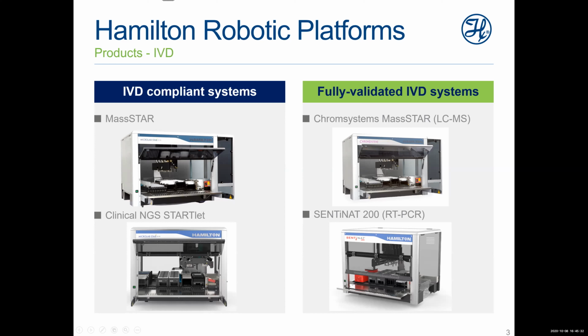So IVD compliance systems, just to make the difference, are open platforms that can be used with the reagents of any kit provider. In order to become an IVD certified system, so we see on the right, the deck and the software package of the platform need to be locked to the workflows of a specific kit provider, and they need to be validated as such.